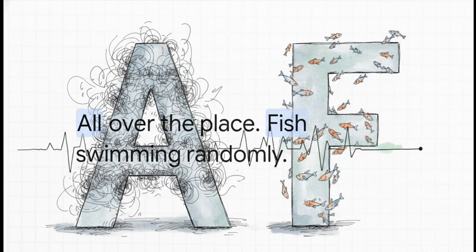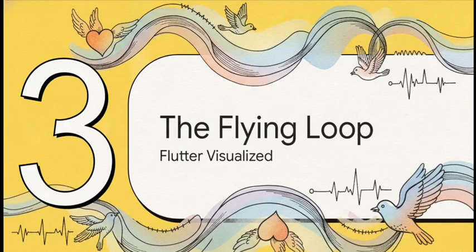You know, you can even use the letters AF to reinforce this. A stands for all over the place, and F stands for fish swimming randomly. So next time you see an ECG with a really messy, squiggly baseline, I want you to immediately picture those frantic fish. All right, let's pivot to our second contender to establish a visual contrast.